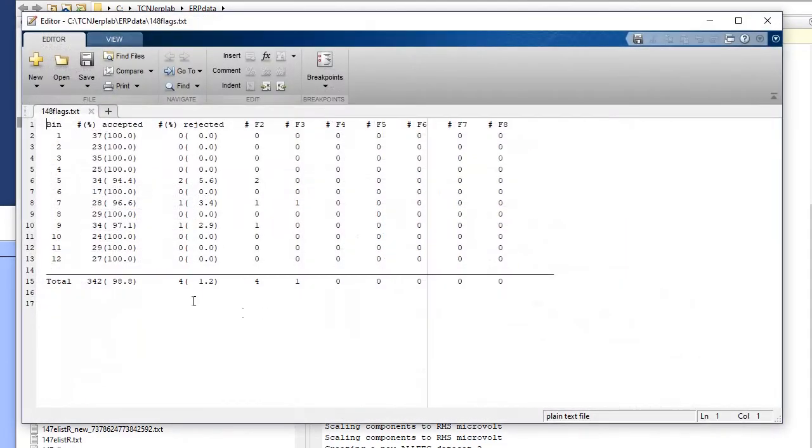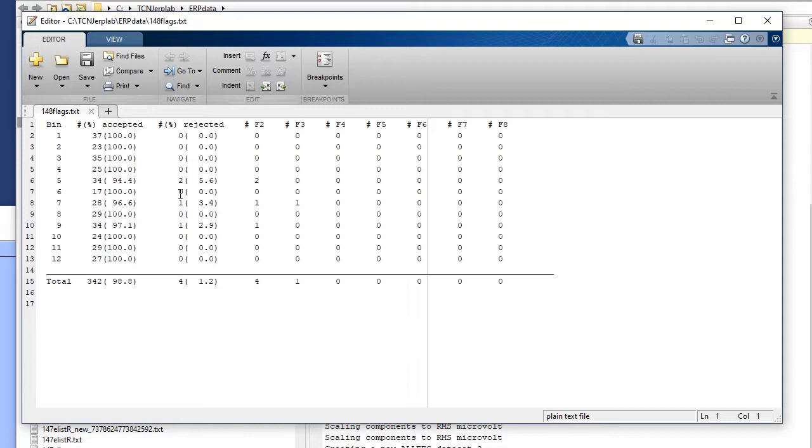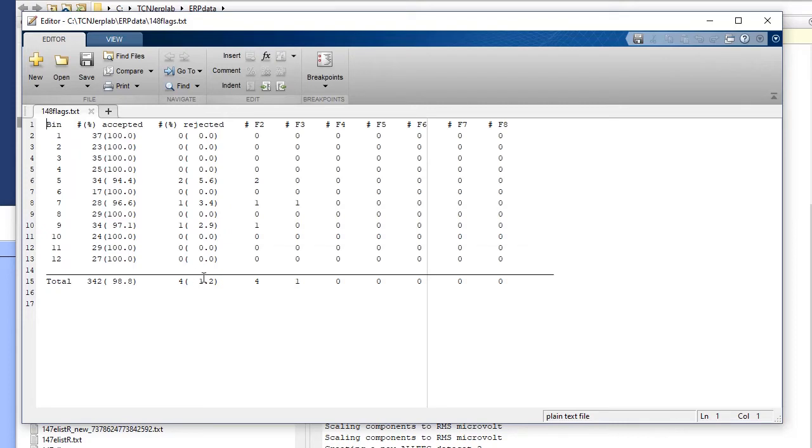We usually call it subject number and then flags.txt. And so let me open this one up. You can see in this particular case, we had 37 trials, which was 100% of the trials that were available. None were rejected in this column. And overall only four trials were rejected, four out of 346 trials were rejected. So very low percentage were artifact trials.